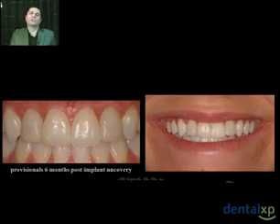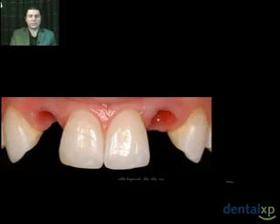And another big advantage to the screw retention versus cement-retained provisional restoration is that I don't have to worry if I inadvertently left some excess cement behind. I don't have to worry about any soft tissue interactions or complications. And probably more importantly, I believe, is if these did come loose, let's say they were cemented on and they came off, it'll be more difficult for Jenna to be taken care of away from Denver, and so consequently there's less stress involved. And as you can see, they did not come loose. This is 6 months later, and now it's time to take impressions.